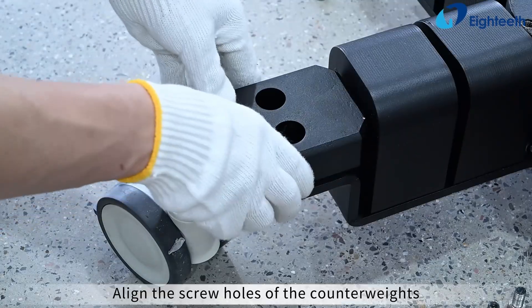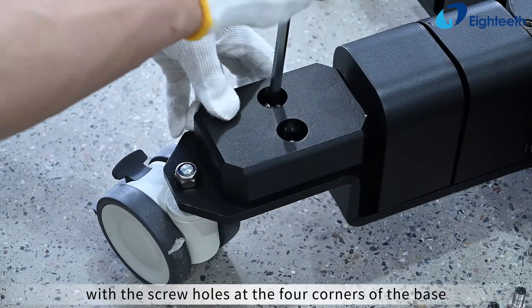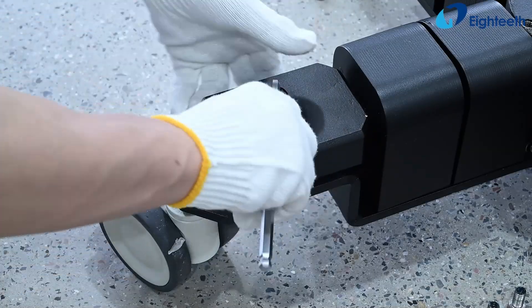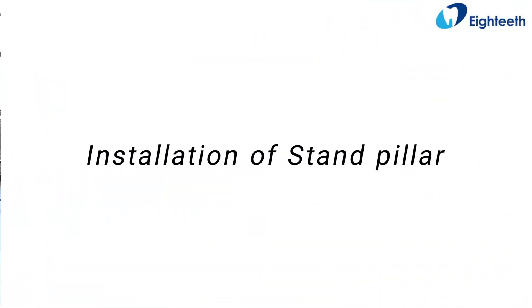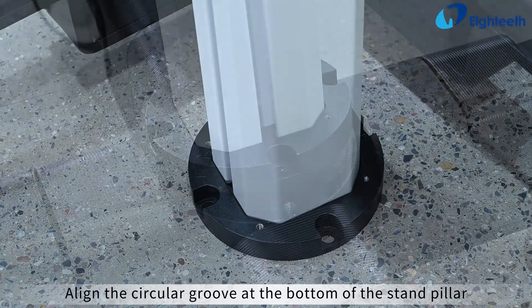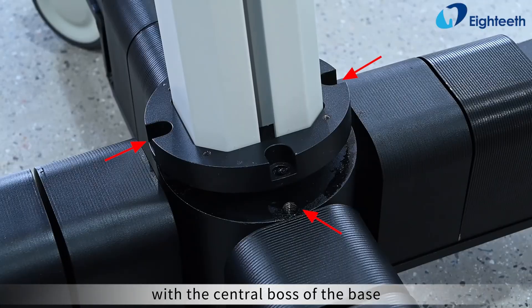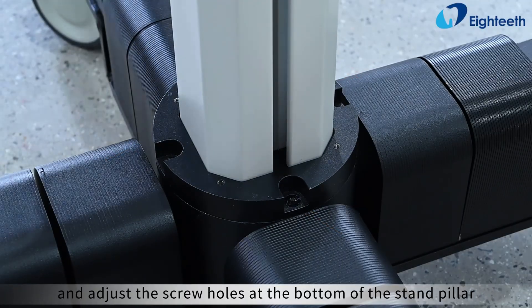Align the screw holes of the counterweights with the screw holes at the four corners of the base and secure them with screws. Take out the stand pillar, align the circular groove at the bottom of the stand pillar with the central boss of the base, and adjust the screw holes at the bottom of the stand pillar to match the screw holes on the central boss.